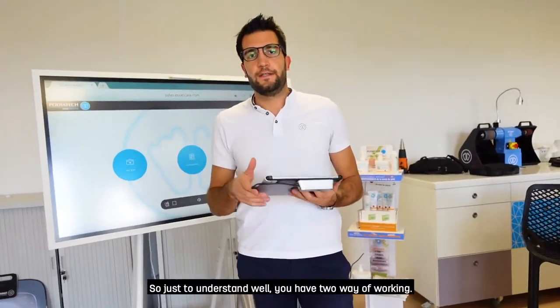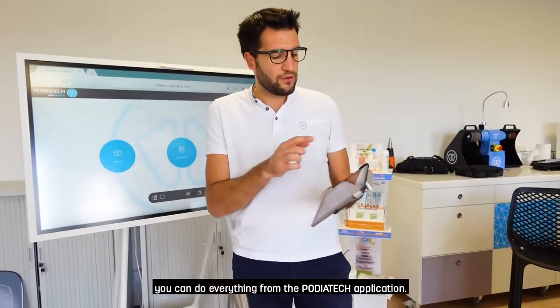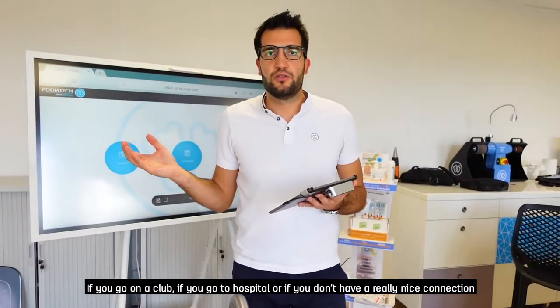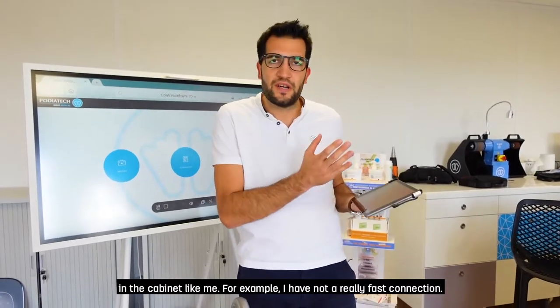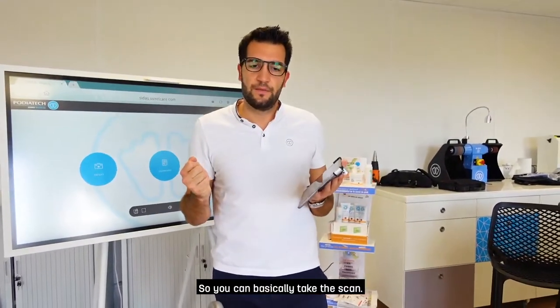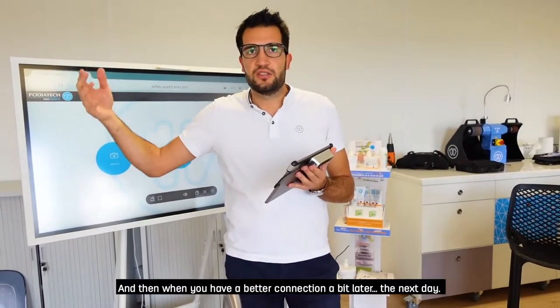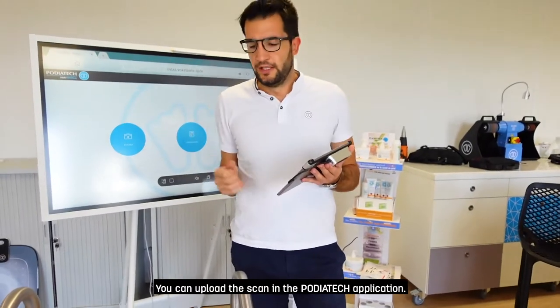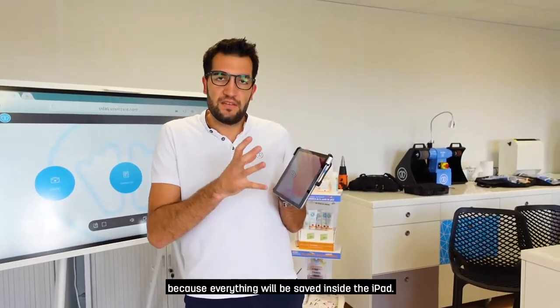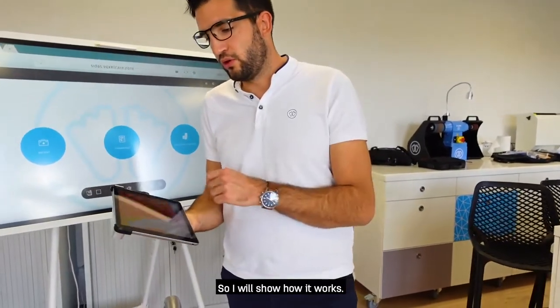There are two ways of working. If you have a really fast connection you can do everything from the Podiatek application. But if you don't have a fast connection in the cabinet, you can start with Voxel Scan because it has an offline version — you take the scan, it will be saved inside the iPad, and then when you have a better connection later or the next day you can upload the scan to the Podiatek application. We advise this way because everything is saved inside the iPad, so no problems — it's less risky.